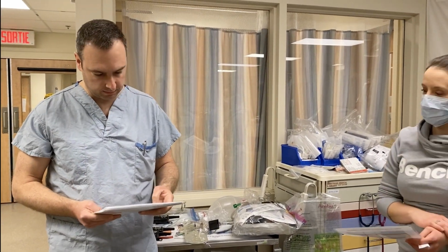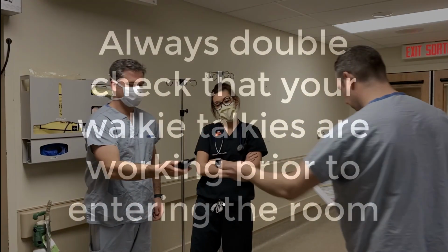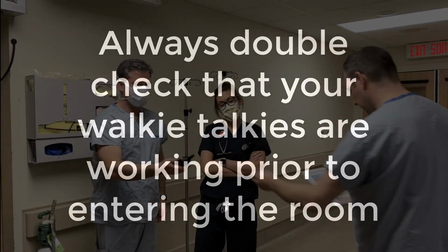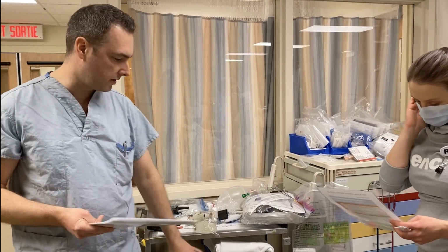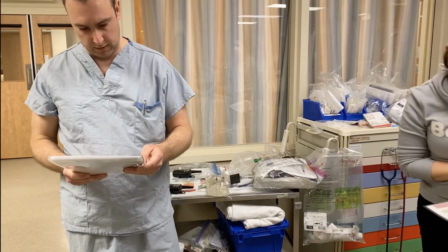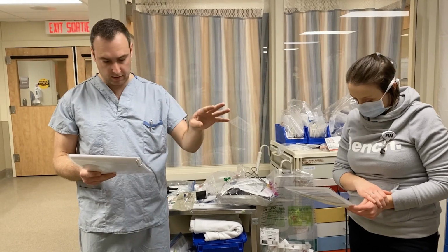And we have our post-intubation sedation and analgesia. Yes, we do. Excellent. In our ante room, we'll keep one walkie-talkie, and we'll actually give that to our ante room team now, so they have it. And we have our arterial line, ABG syringes, again, kept all in this blue container for when we move forward. We have our Foley catheter kit as well in this blue container. And outside the room, we have our med card if we need it.